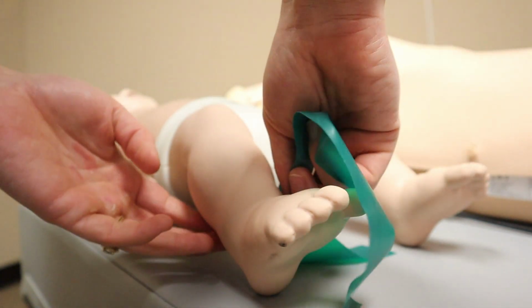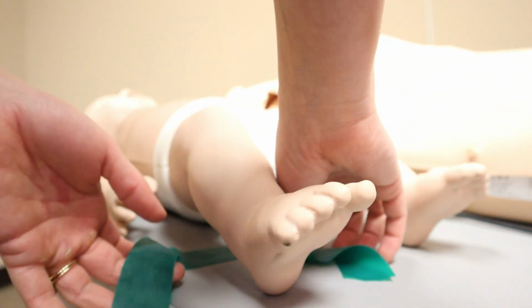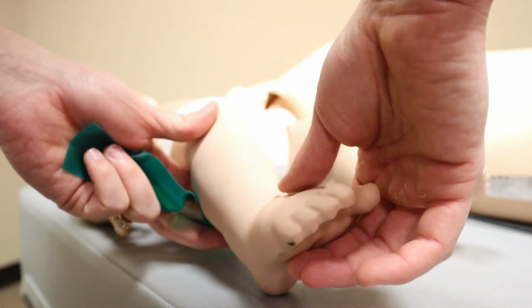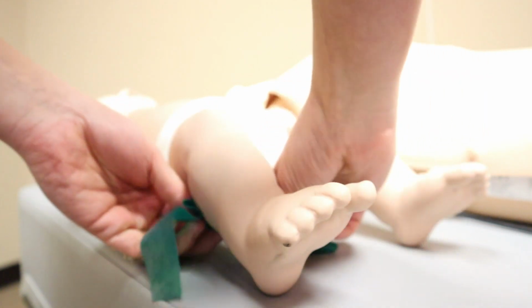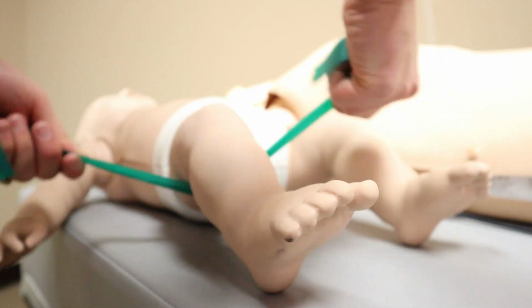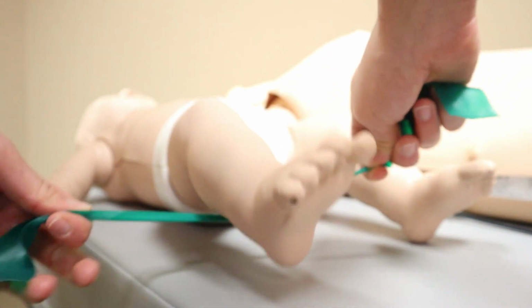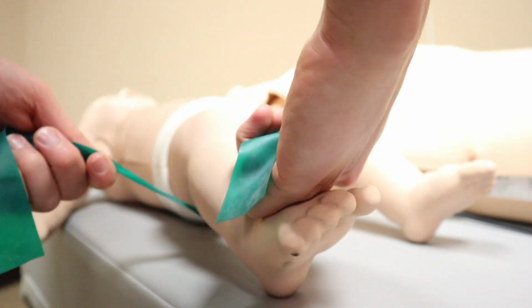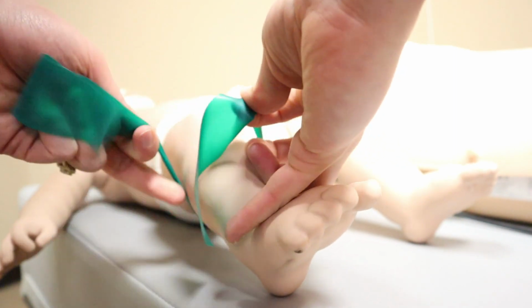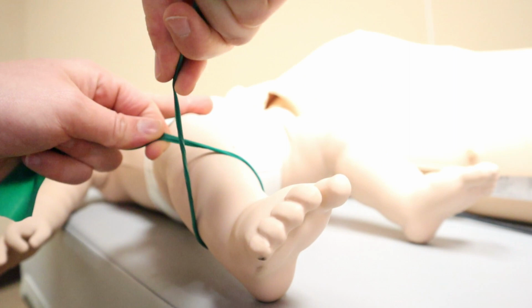Now I'll do it at a different angle for this pediatric patient. This angle is if you were standing on the patient's right hand side at the bedside. A lot of pediatric patients get foot IVs, at least that's what I have seen. So we're gonna do that. So I'm going to place this tourniquet up near, let's do the calf area. So you pull it really tight again, and make sure you have someone to hold that leg down, or else they're gonna be squirming all over the place. And you cross, again, cross those bands.